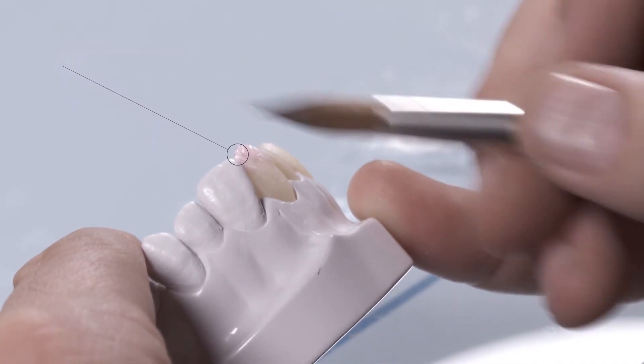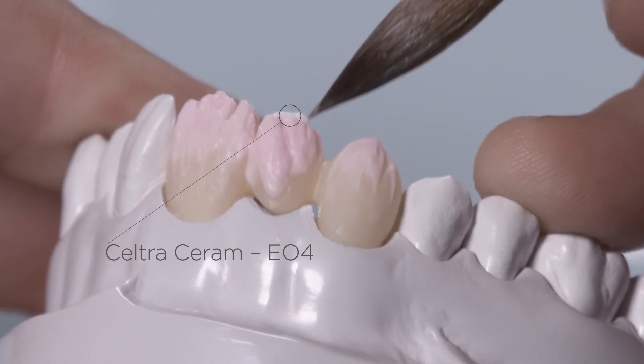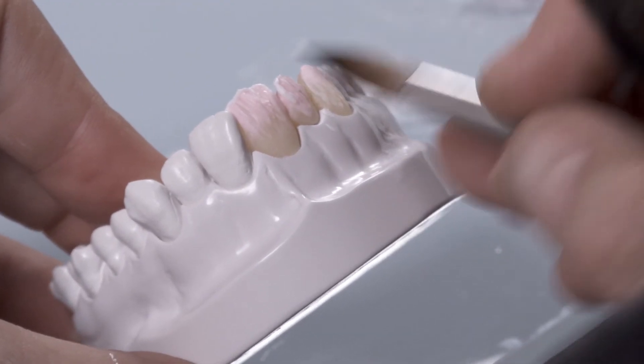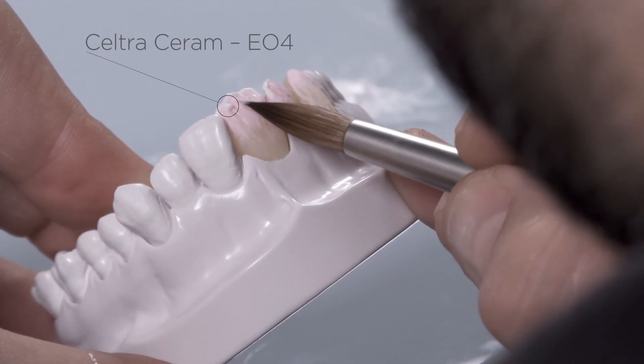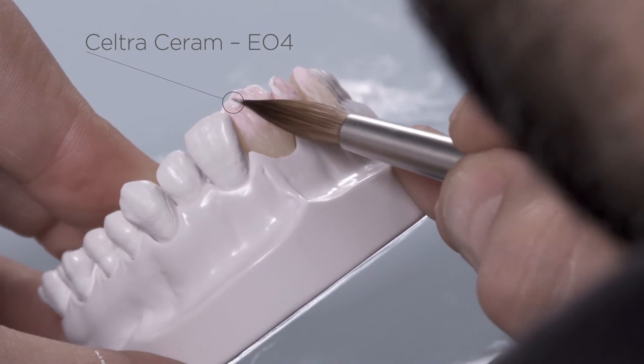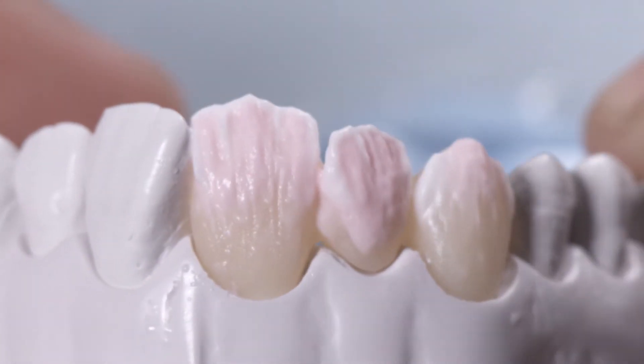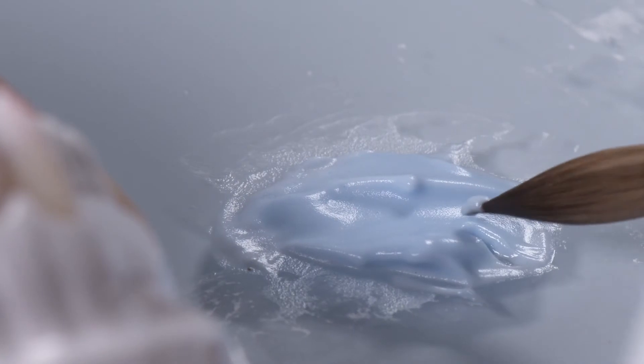Highlight the incisal edge with Enamel Opal EO4. Emphasize the areas between the mamlons and on the incisal ridges with EO4 for more depth effect. Then complete the build-up of the restoration with Enamel E1.